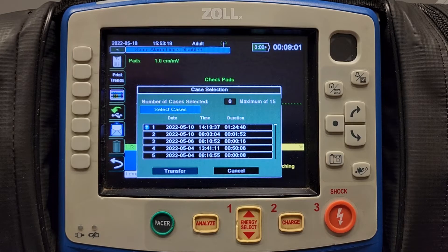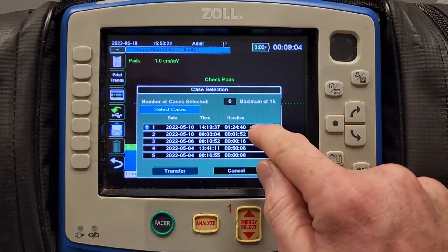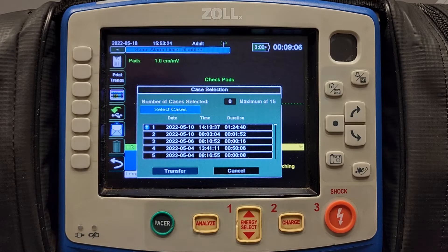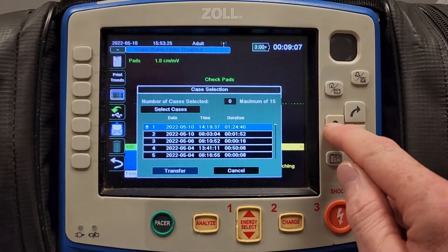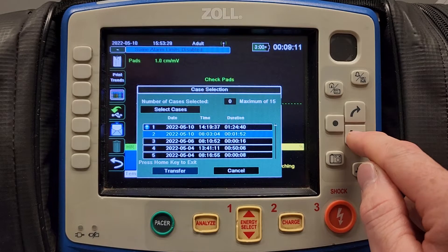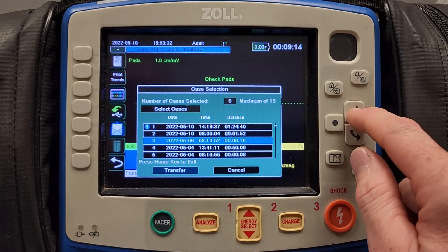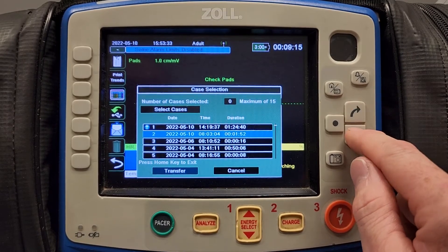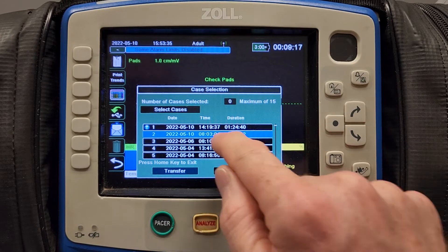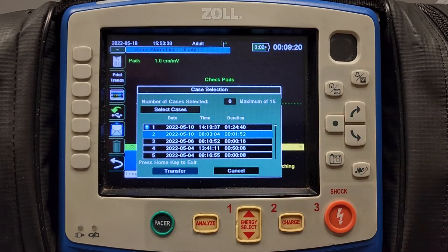In this menu, you will hit select cases, which will allow you to select from available cases. A case is generated each time the monitor is turned on. The timestamp correlates to the time that the monitor was turned on.